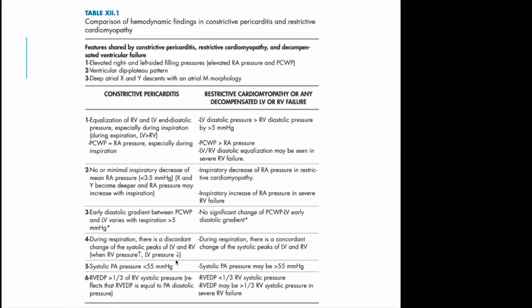The other thing to consider is this concept that we talked about with ventricular interdependence, or the discordant systolic peak LV and RV pressures during respiration. Whereas in a restrictive cardiomyopathy and severe ventricular failure, there are concordant changes.